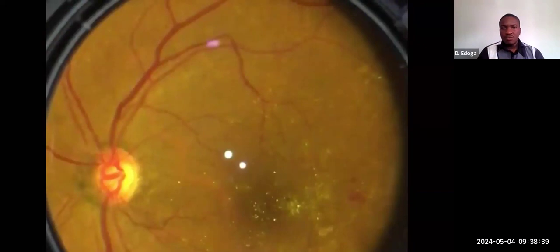So the light from the iPhone is usually a small, white circle of light, and this light is from the flash of the iPhone. But when you have reflections from the light in the room, it usually takes on different colors, usually more colorful than the light of the iPhone.